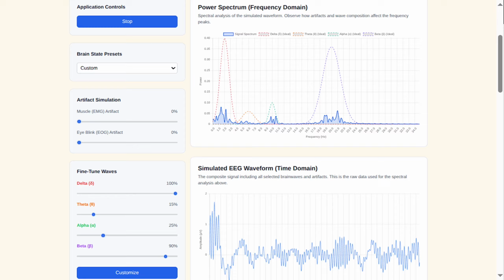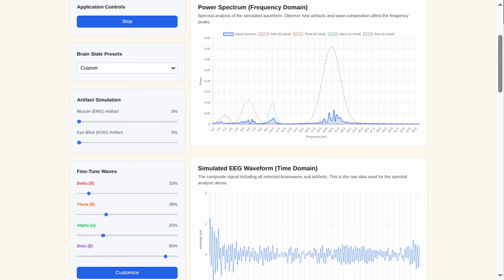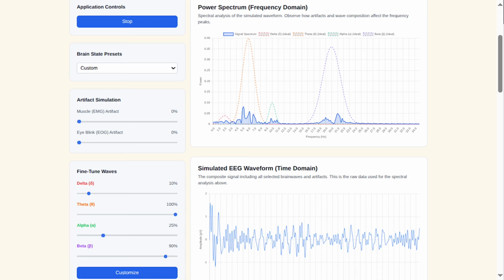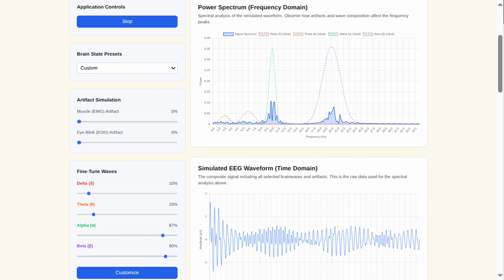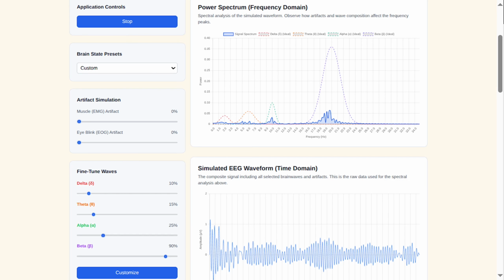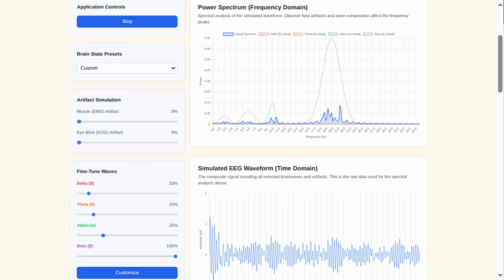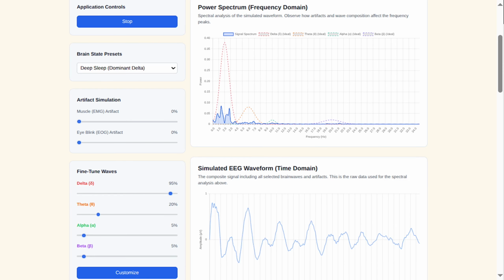Subdermal electrodes, also known as subcutaneous electrodes, are placed just under the skin. They provide better signal quality than surface electrodes by reducing noise from hair and skin impedance. They're often used in research, epilepsy monitoring, and some BCI applications, offering a middle ground between non-invasive and fully invasive techniques.